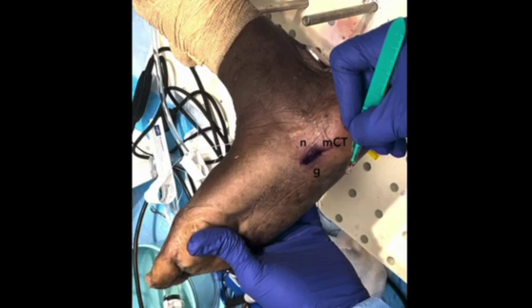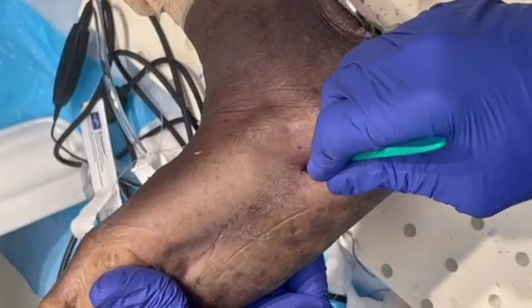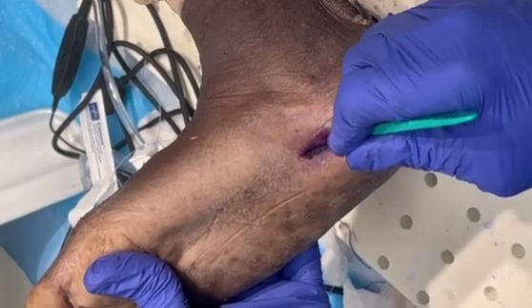A 5 millimeter incision is made directly over the medial aspect of the plantar fascia insertion, just distal to the medial calcaneal tubercle and proximal to the border of the glabrous tissue. Careful dissection down to the plantar fascia insertion is performed utilizing a hemostat, taking care to avoid dissection dorsal to the fascia to prevent iatrogenic nerve injury.